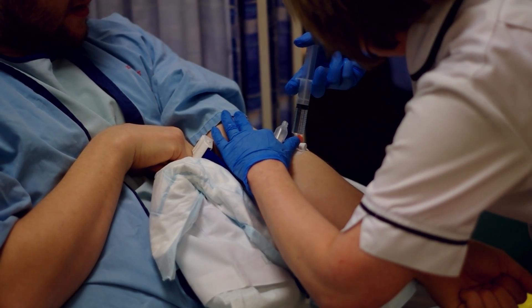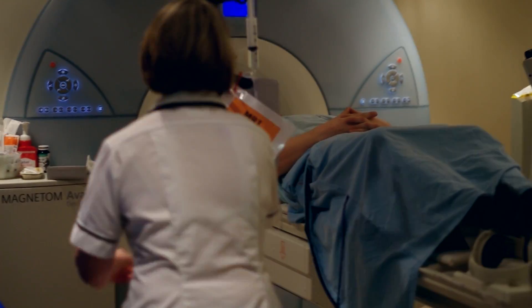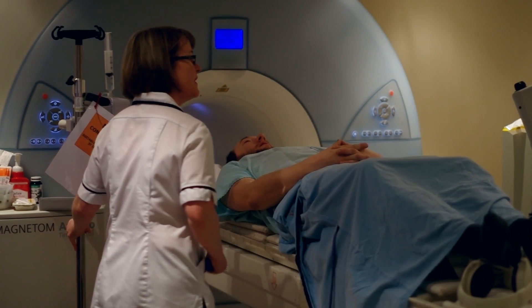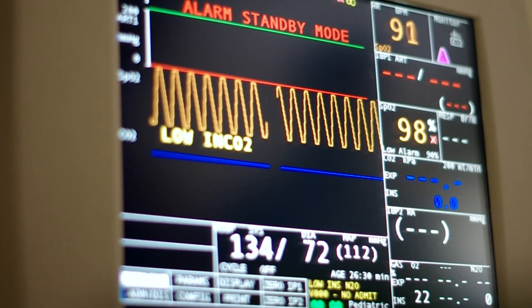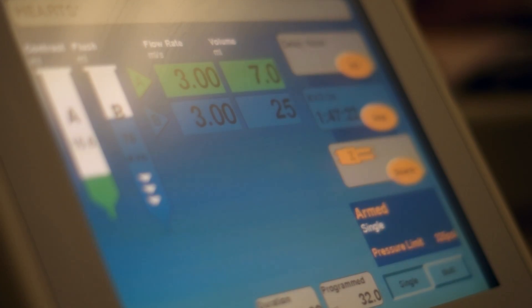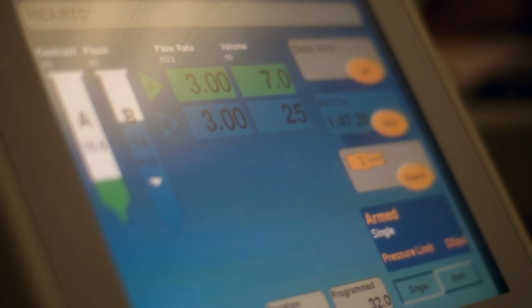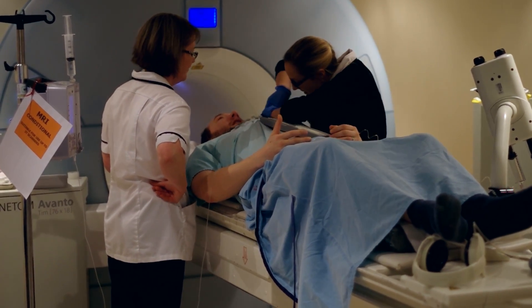A small plastic tube called a cannula will be put into a vein in each arm so we can give you dye and the adenosine medicine. Once you're in the scan room you'll be asked to lie down on the scanner bed and you'll be asked some more safety questions. You'll have the chance to practice holding your breath before the test starts, and you'll be asked to hold your breath repeatedly throughout the scan.